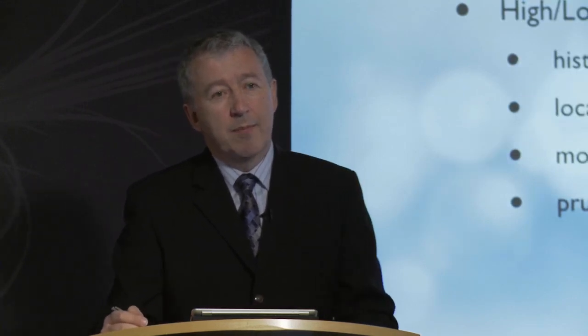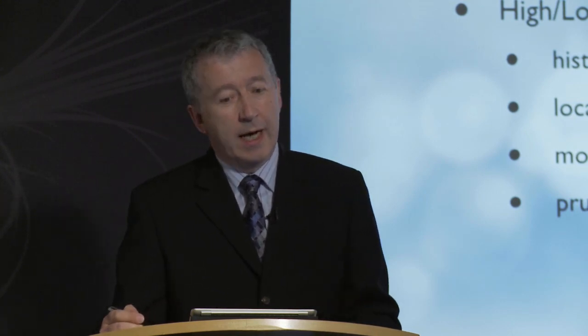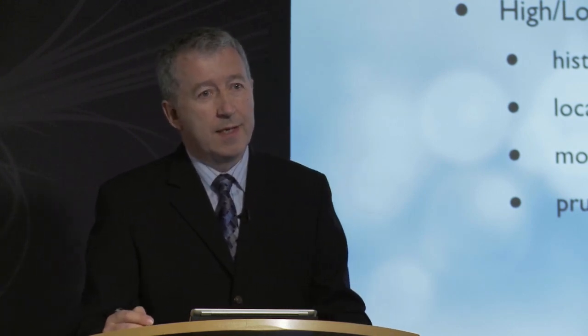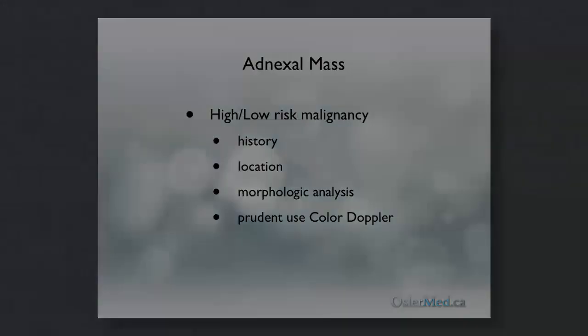So how do we set about stratifying adnexal masses as having a high or low risk for malignancy? Well, it's a combination of things, including clinical history, the location or organ of origin of the mass, a careful morphologic analysis, and prudent use of color Doppler.